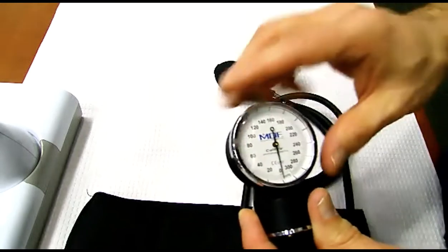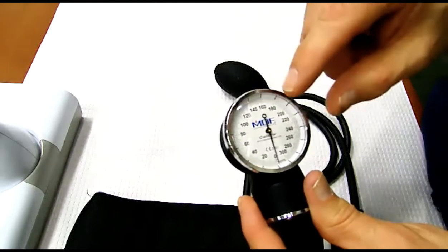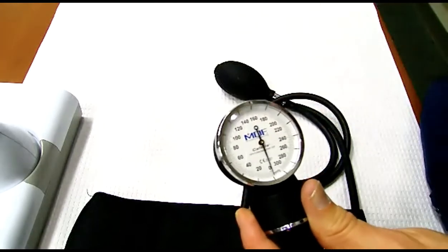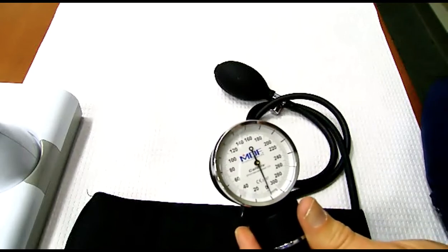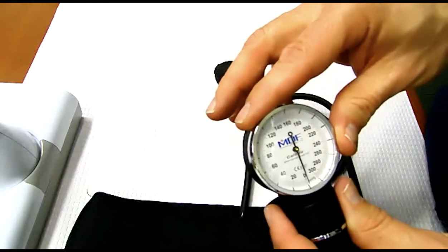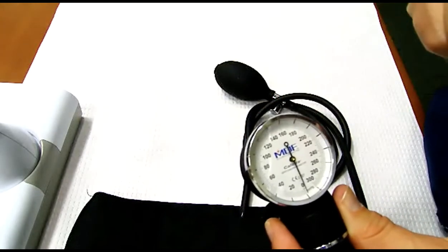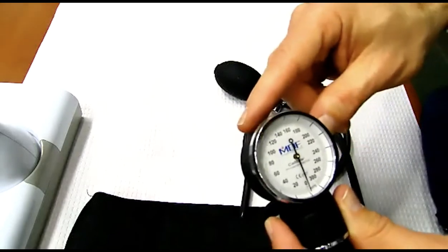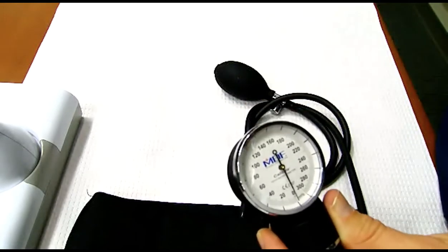Okay, which means then, how much is each little notch worth? There are five notches between a number and the big notch, and another five between that notch and the one above it. So every little notch is worth 2 millimeters of mercury. So when that pin is pointing directly at a notch, it's going to be an even number. You can only directly measure 2 millimeters of mercury for each little notch.